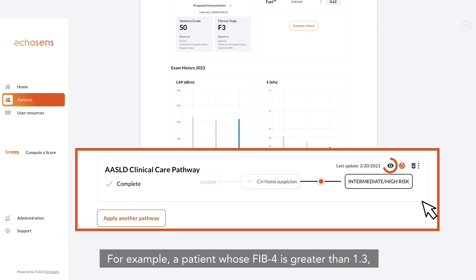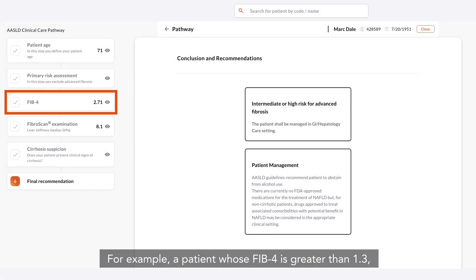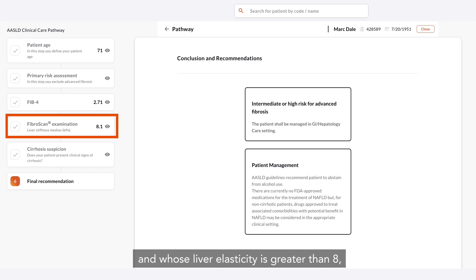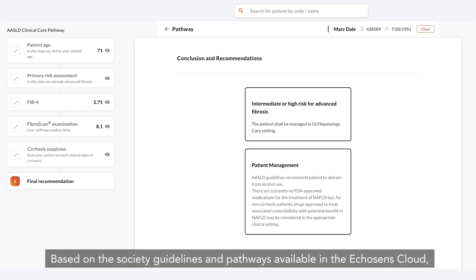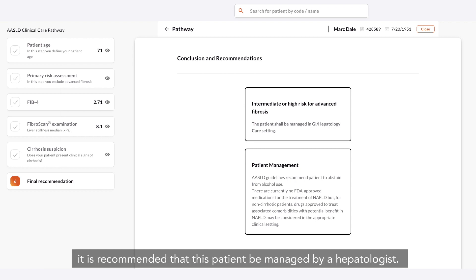For example, a patient whose Fib4 is greater than 1.3 and whose liver elasticity is greater than 8 is considered at high risk for advanced fibrosis. Based on the society guidelines and pathways available in the Echosense cloud, it is recommended that this patient be managed by a hepatologist.